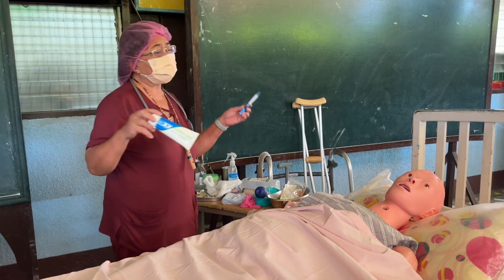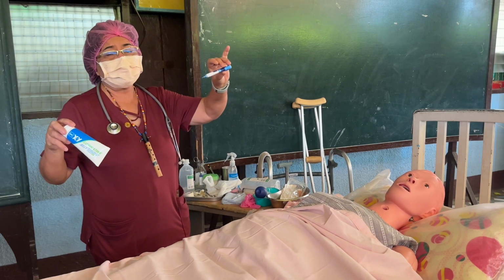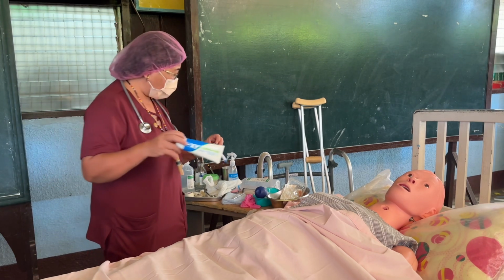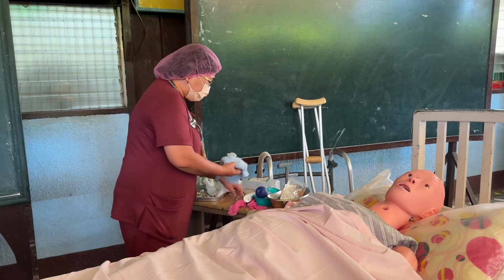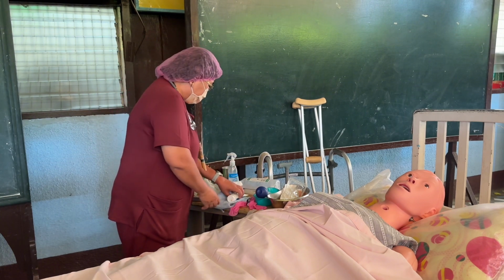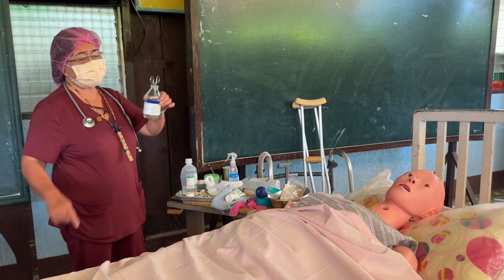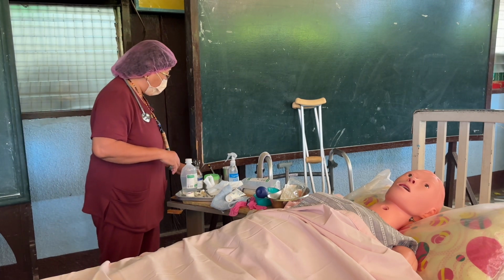We have to prepare a pen light to check the nostril for any septal deviation, abrasion or dirt in the patient's nose where we're going to insert. And then we have a washcloth to freshen up the patient after insertion. And then scissors, plaster, and therapeutic gloves in case we have to make use of them, just prepare them always.